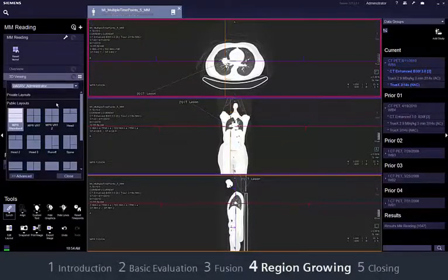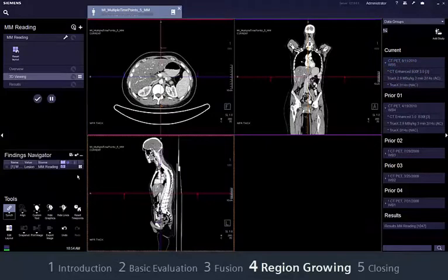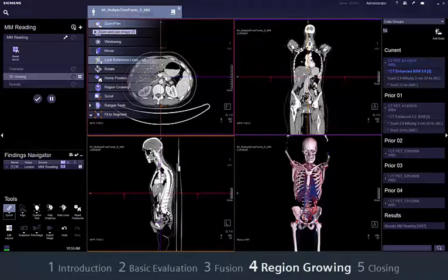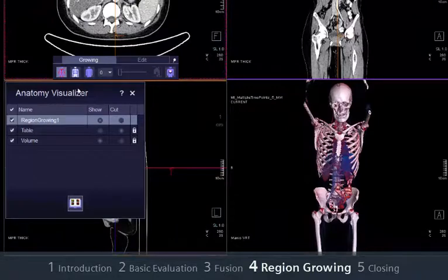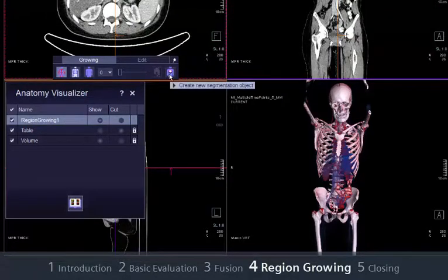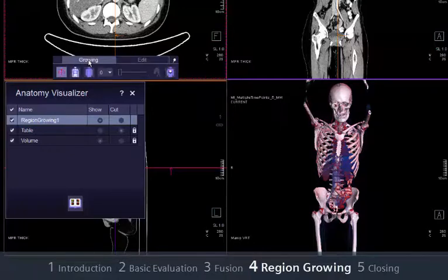Region Growing and Anatomy Visualizer are two features that can be used to segment and highlight lesions, for example for a referring physician or a surgeon. To start, open a 3D layout and select Region Growing. The Anatomy Visualizer dialog shows a list of available anatomical structures. To start a new object, select Create new segmentation object. In general, there are two ways to segment anatomical structures: via growing or via interpolation of different layers. For this case, we choose Growing.